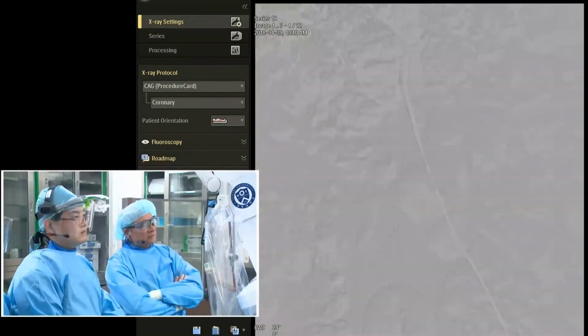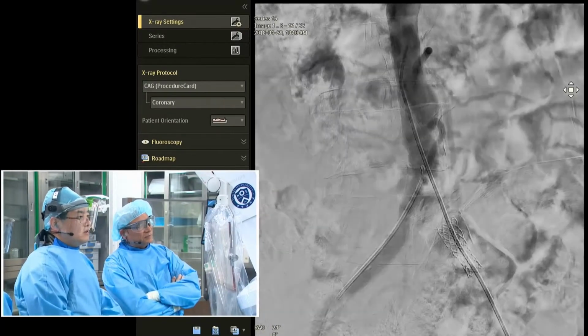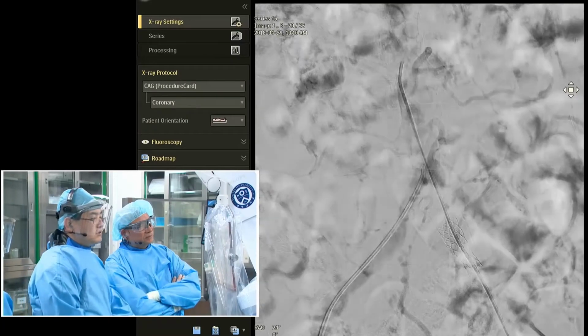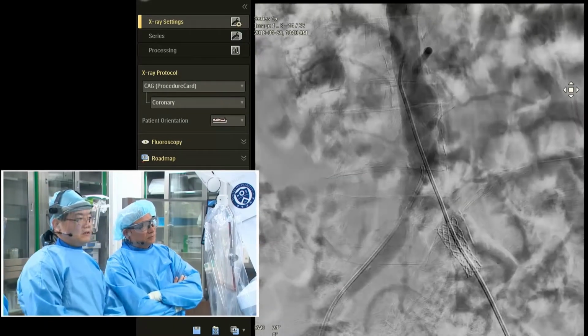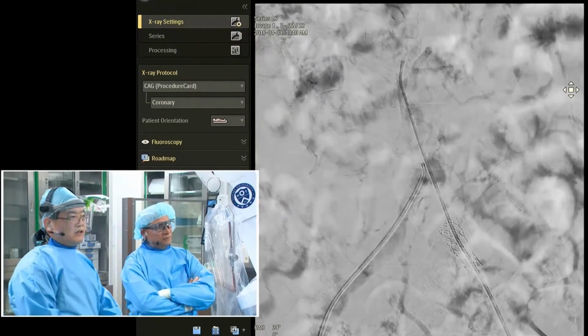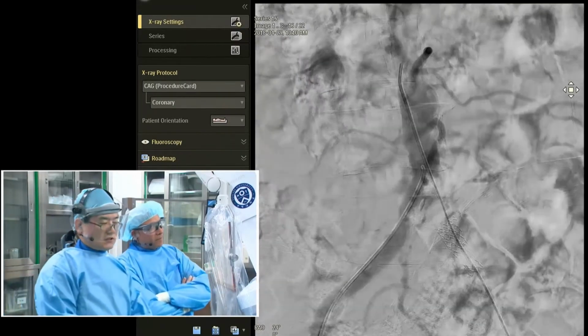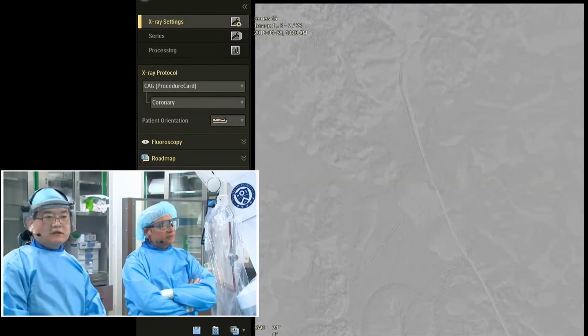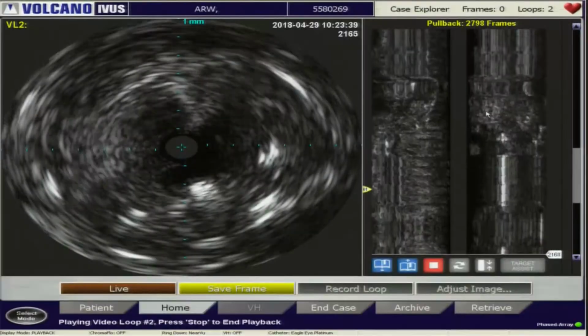Looped approach almost. So we checked the angiogram and hemodynamics. It's a very good penetration, and we checked IVUS from the common iliac to the external iliac to visualize the stent morphology. Initially, we checked it in the CT scan. So, show the IVUS. Yeah. Very nice.